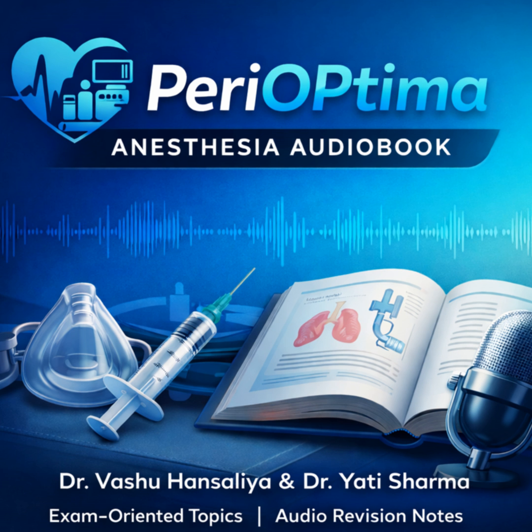And although the i-gel fits this description because it is cuffless, its clinical importance is really defined by that GDC, which usually places it in the second generation category for any practical discussion. And the other category? 2. Cuffed pharyngeal sealers. These devices have active esophageal sealing cuffs, which means they target the esophagus much more definitively than the first two groups. Examples would be the laryngeal tube, or LT, and the esophageal tracheal combitube, the ETC.